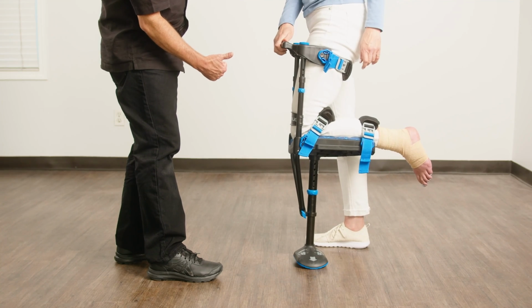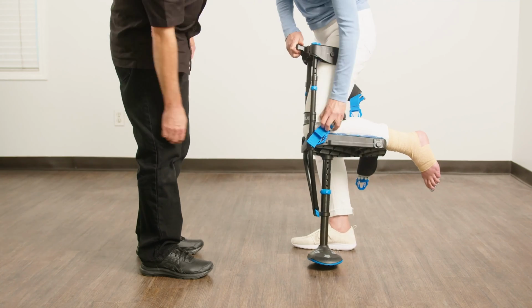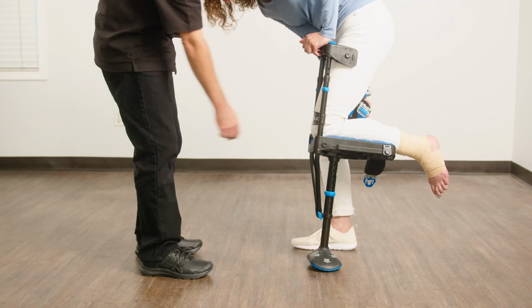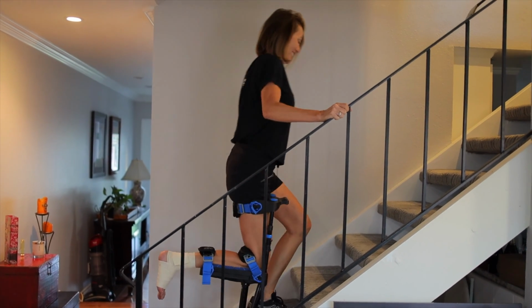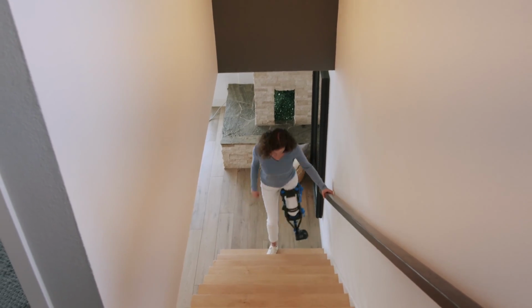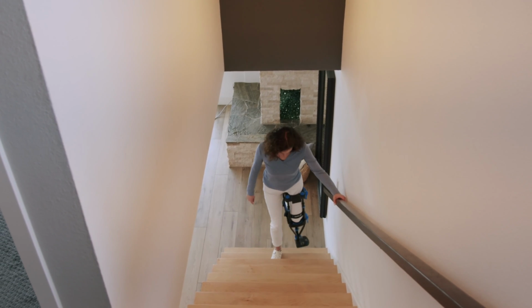The process may be slow this first time, but by the end of day 2, the patient can self-don and doff in about 10 to 15 seconds. Stairs. Stairs can be navigated easily and safely with the iWALK crutch. Training on stairs can be done as soon as your patient demonstrates proficiency at walking hands-free.